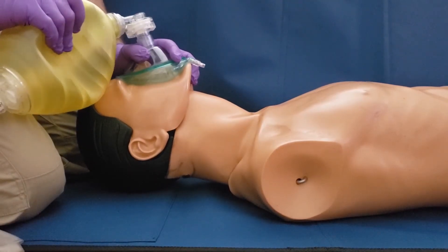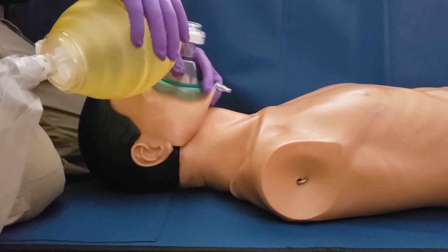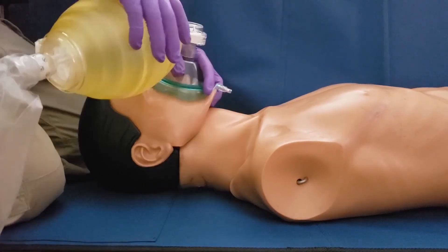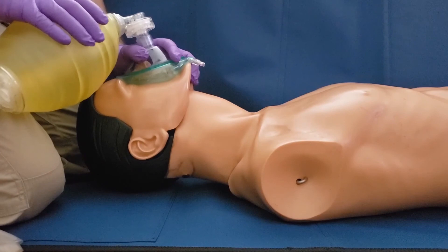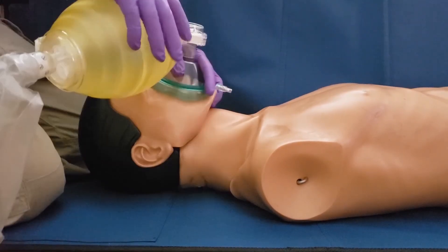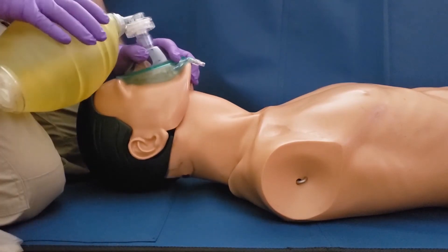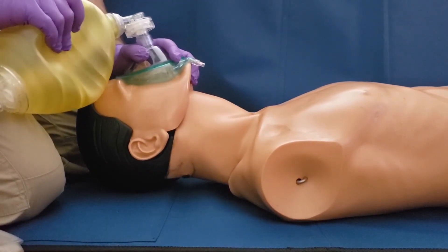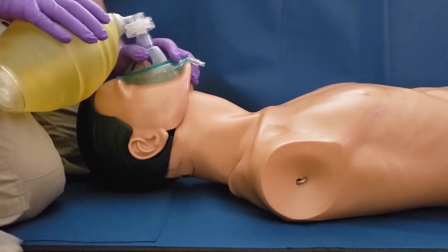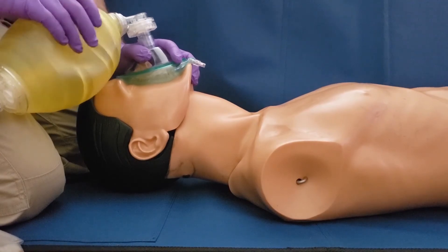Even with an effective EC clamp and an effective head tilt chin lift, we still have to seal the mask to the patient's face. As long as we have not adjusted the fingers of our E when we did our head tilt chin lift, we have essentially created a hinge. Instead of squeezing with your fingers, if you push down gently with your thumb over the bridge of the nose, that pressure will be uniformly dispersed throughout the mask to create an effective seal on the patient's face.